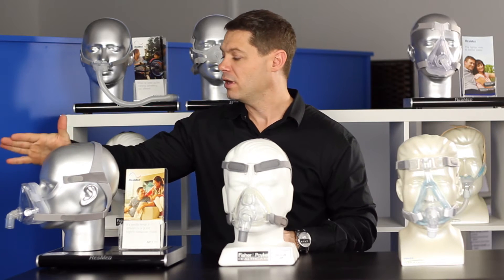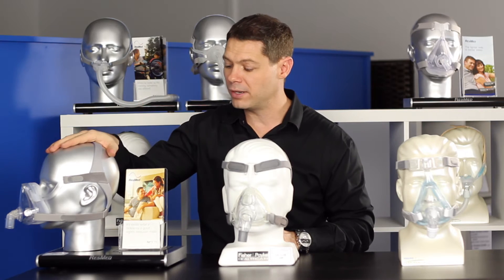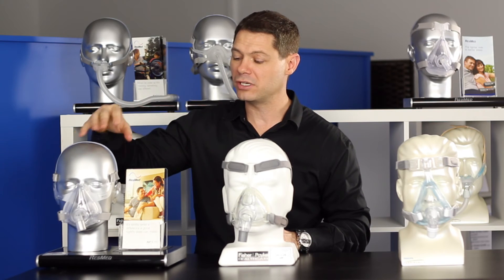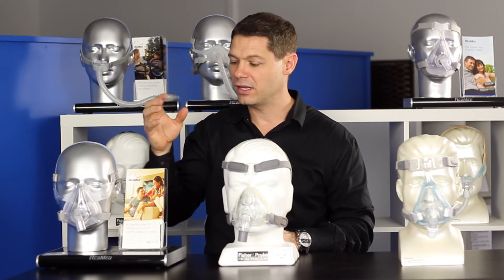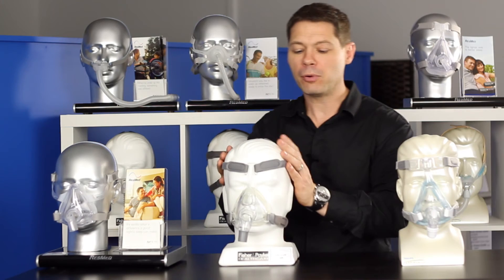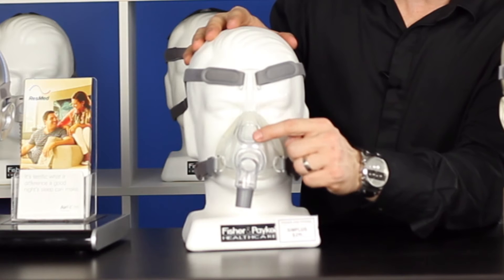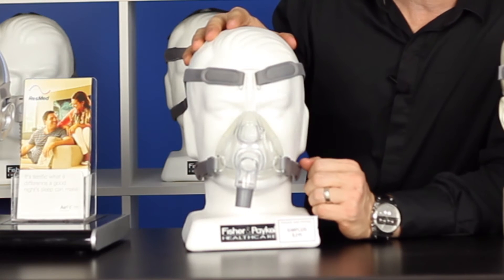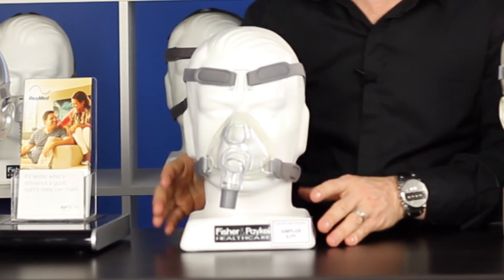So the Quattro Air and the F10 mask are a great mask by ResMed. The cushion is very light and they've come a long way with their full face masks. Fisher and Paykel have a mask called the Simplus. It still has the exit valve which streams air over the person lying next to you, so a bit stronger exit air on this one than on the ResMed.